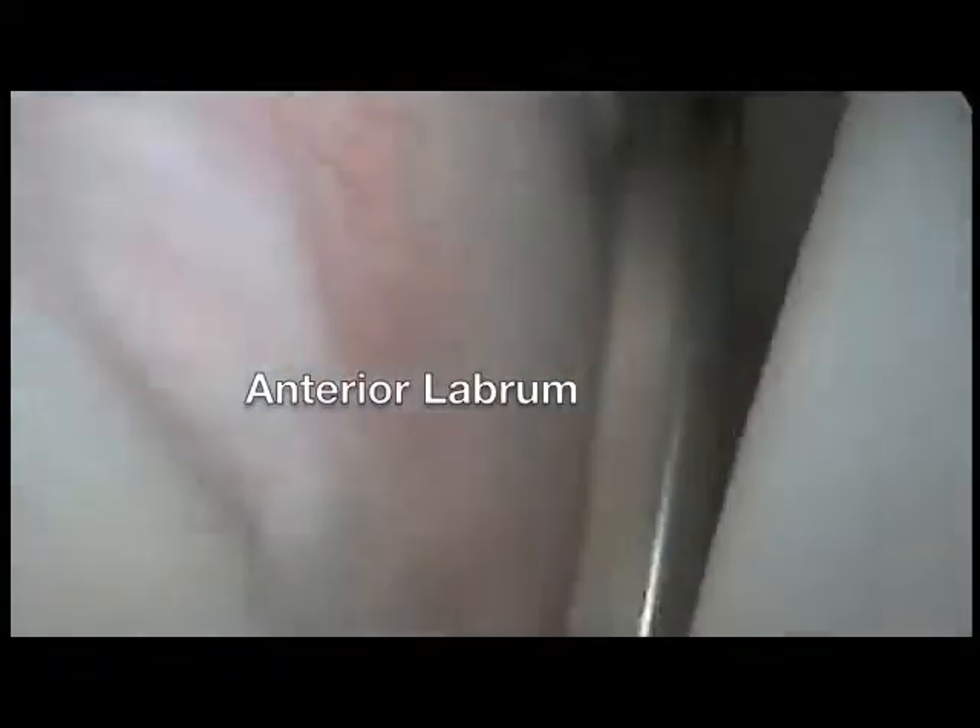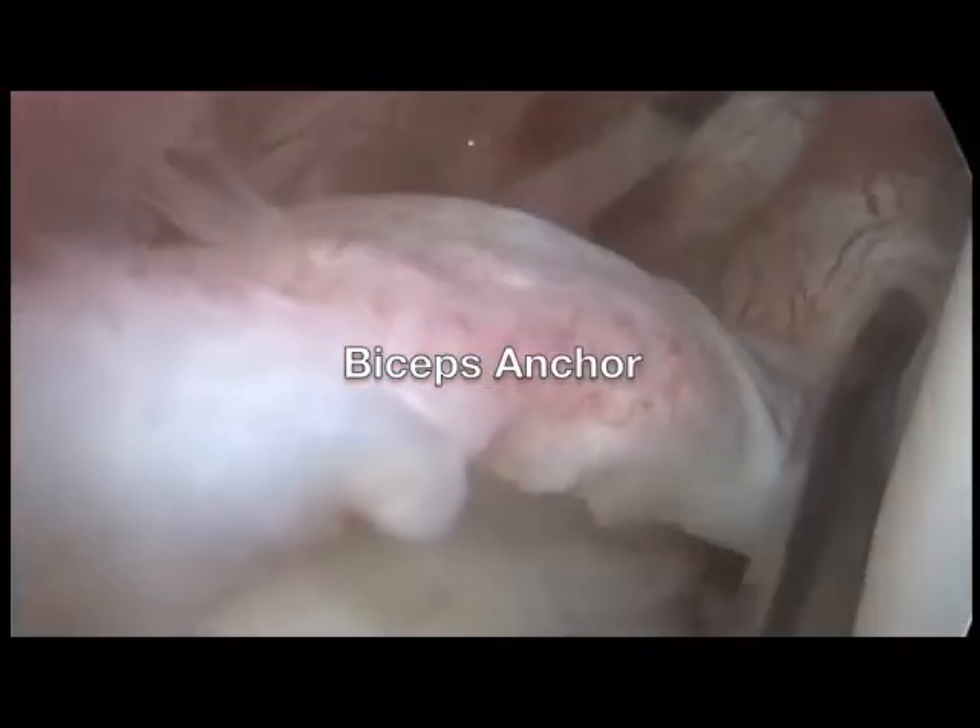A portal is made just above the upper border of the subscapularis and a probe is introduced into the joint. You can feel and palpate different aspects of the joint with this instrument. This is the anterior inferior labrum, which is firmly attached, and the superior labrum, which feels normal, and the biceps anchor is quite stable.